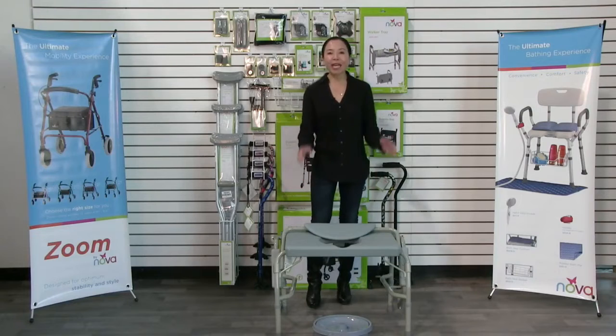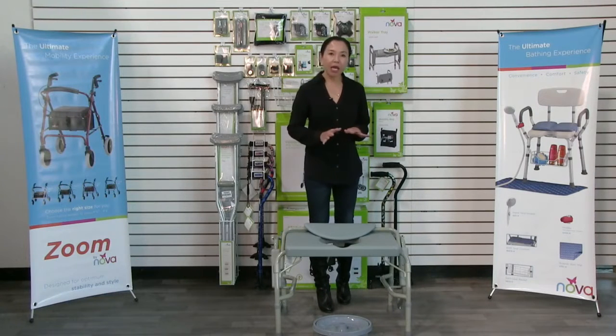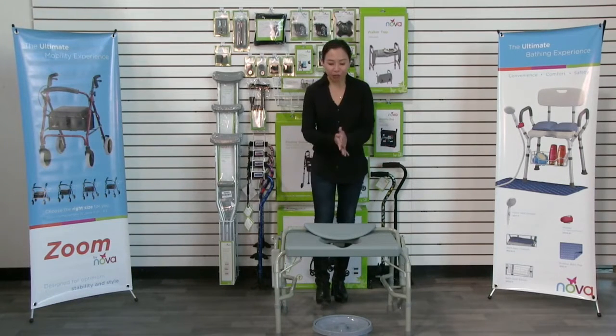This video is about the Nova 8583 500 pound weight capacity heavy-duty commode with drop arm. I'm going to show you the quick and easy assembly and then the great features of this product.